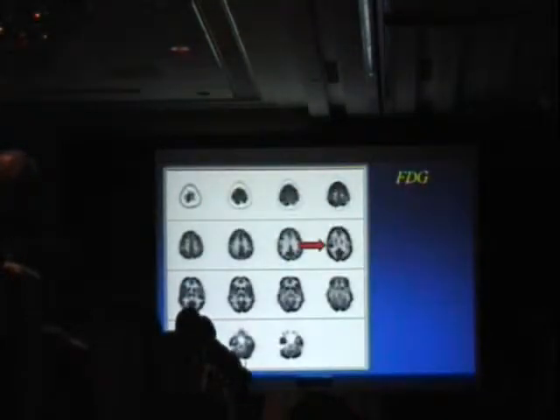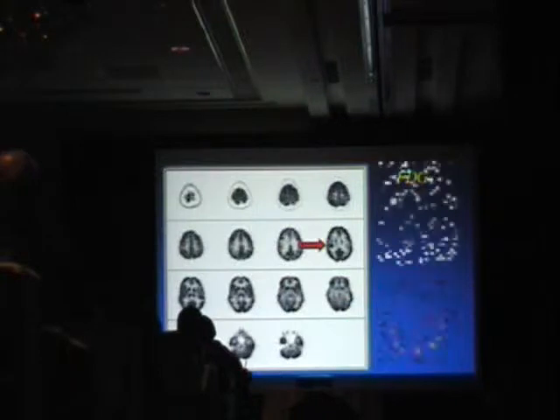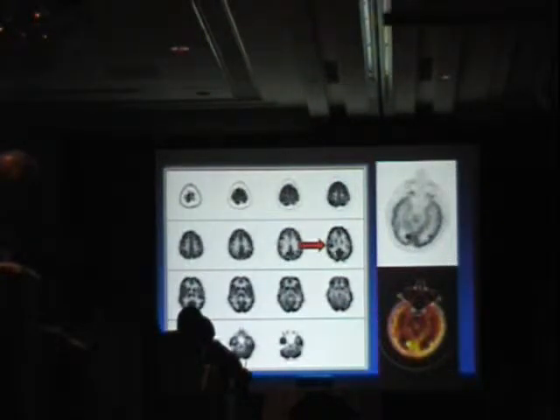This is the tumor within this patient. You can see how poorly it stands out against the background. You can confuse this with just a sulcus. When you come in there, you see the bend of the sulcus, the hairpin, you also see increased uptake like that. You see that here, here, here, and so on. And so you could easily overlook that. But that is the tumor.